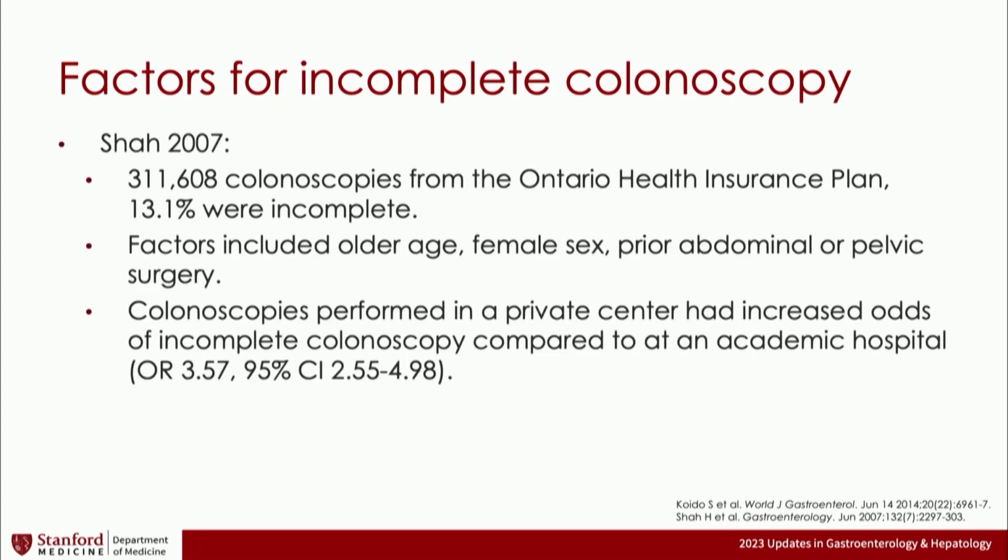Shah then followed up with a study in 2007 looking at 311,000 colonoscopies that were performed through the Ontario Health Insurance Plan and found 13.1% incomplete colonoscopies. Factors here included older age, female sex, prior belly surgery. In addition, they found that colonoscopies performed at a private center had increased odds of incomplete colonoscopy compared to when it was performed at an academic hospital, with an odds ratio of 3.6.